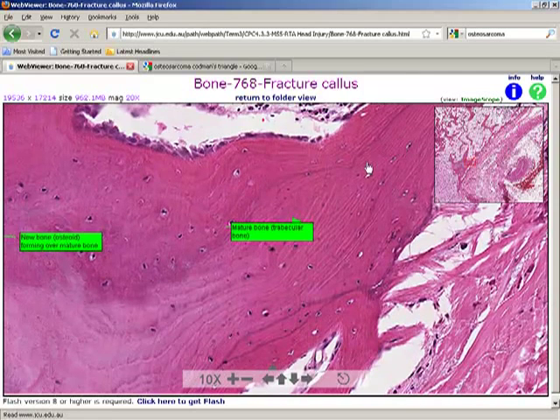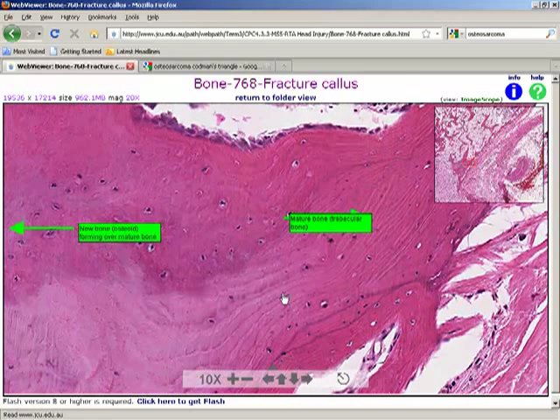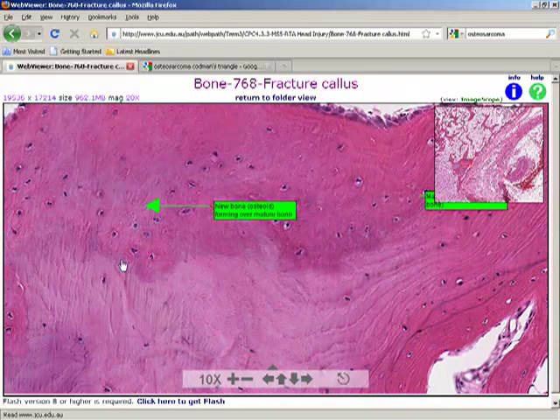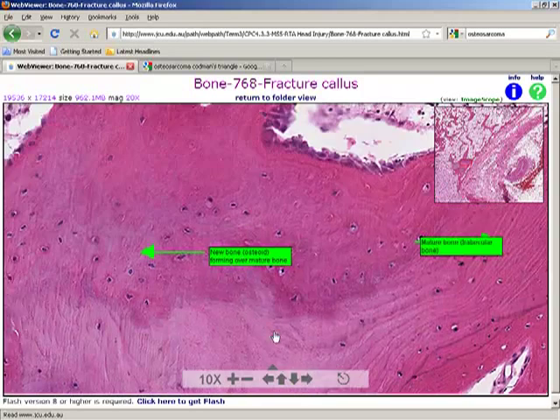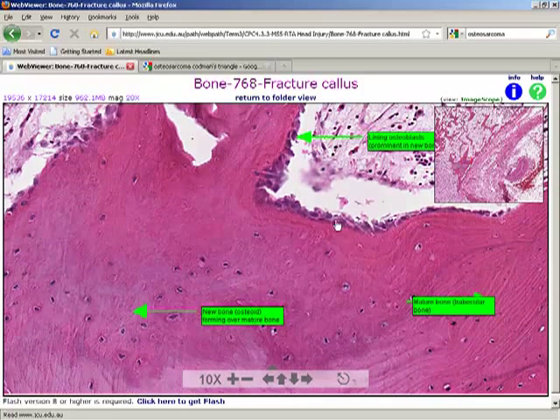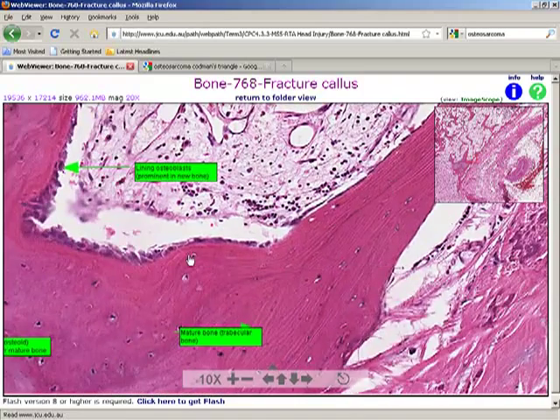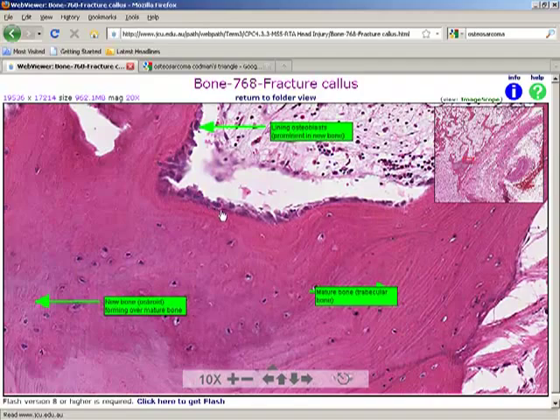Okay. Now as we move, this bone is growing newer bone which is slightly irregular. There are no fine lines here and they are still bluish. That means DNA, RNA still active there. And this area has prominent osteoblasts compared to resting osteoblasts here. See that they are very thin, pale, thin, non-active, but as we move towards this new bone, these are active osteoblasts.